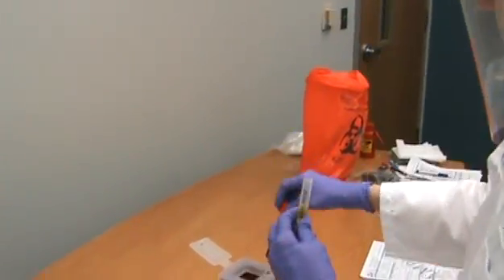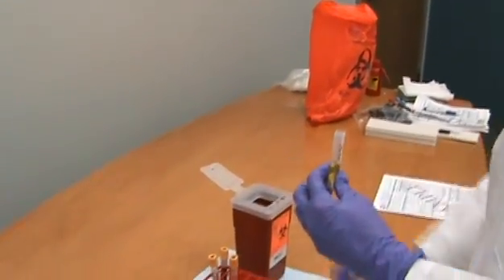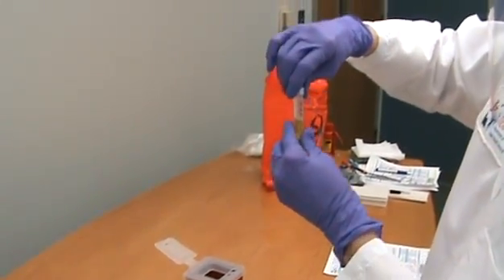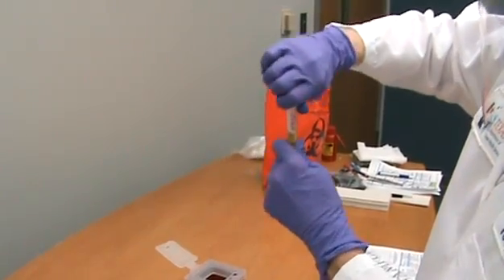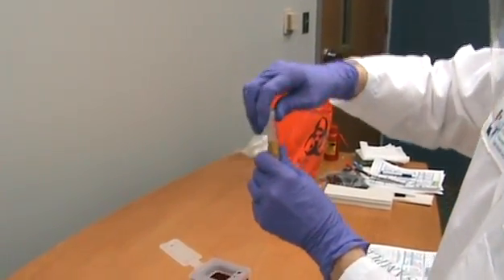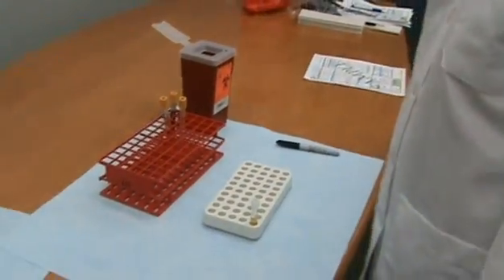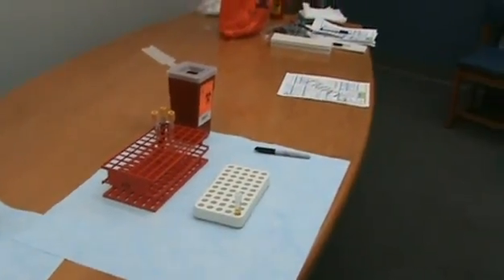Place the stopper in the red top tube and discard the tube into the biohazard container. Cap the transport tube, ensuring that the cap is secure. Pouring the specimen serum from the blood collection tube into a transport tube is discouraged for safety reasons.